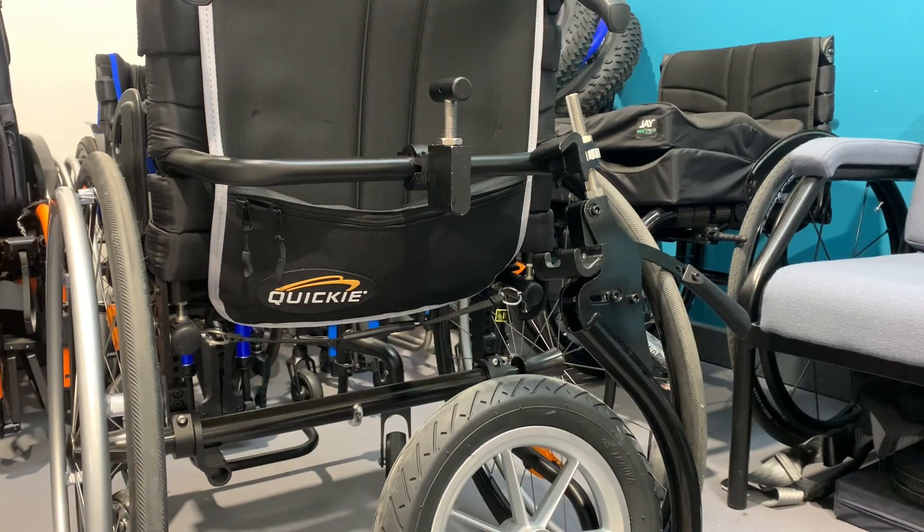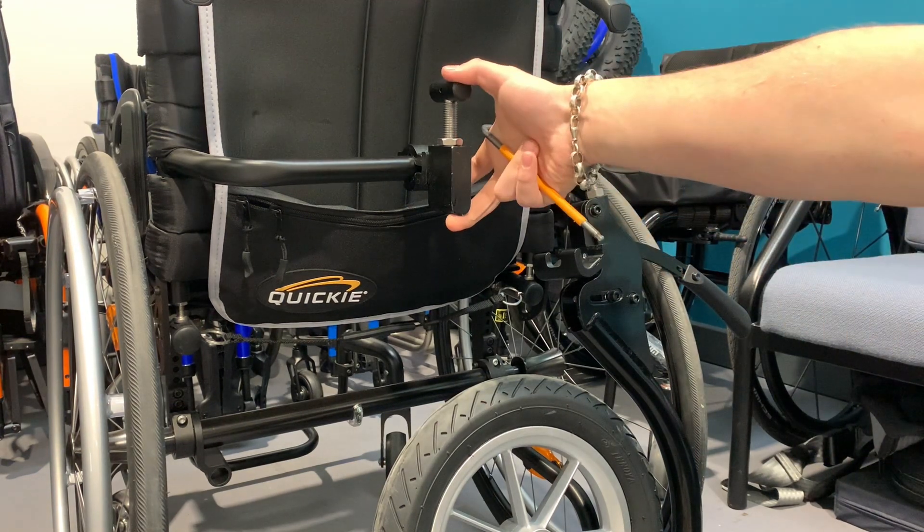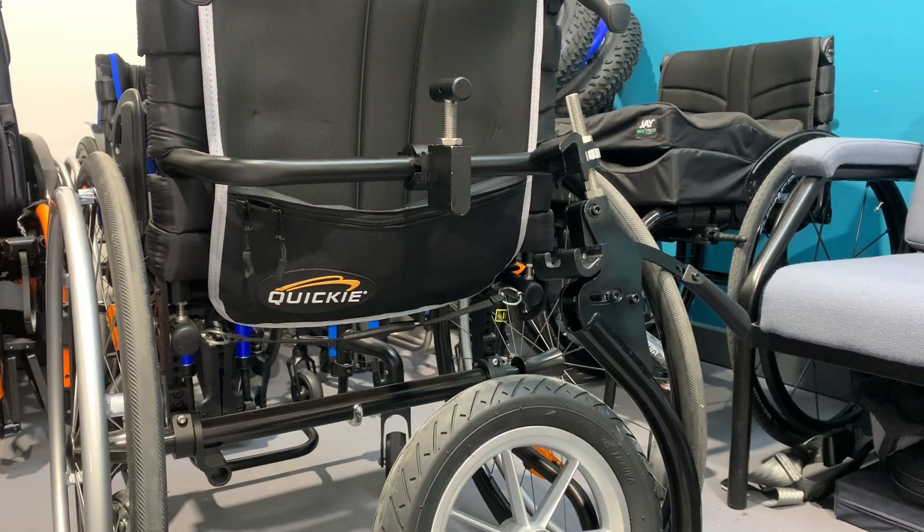Hi there, it's Kenzie. I'm just going to be doing a quick video on how you attach the single arm track wheel clamping attachment to the back part of your active wheelchair.